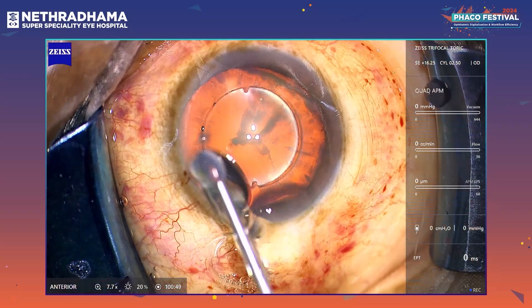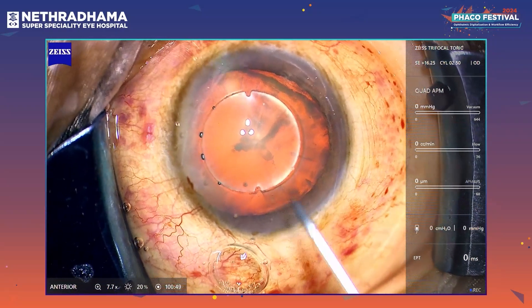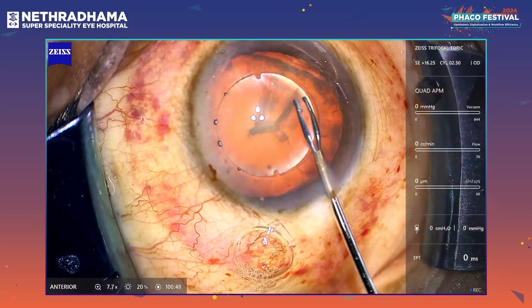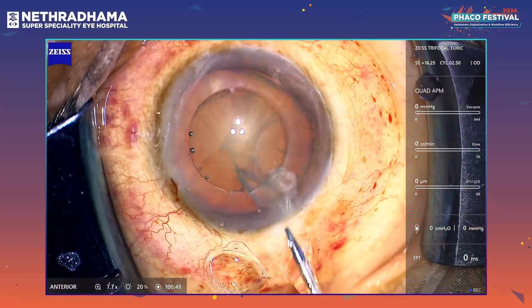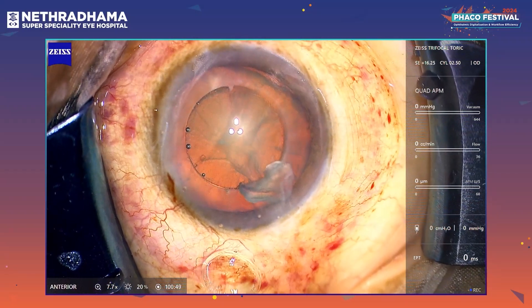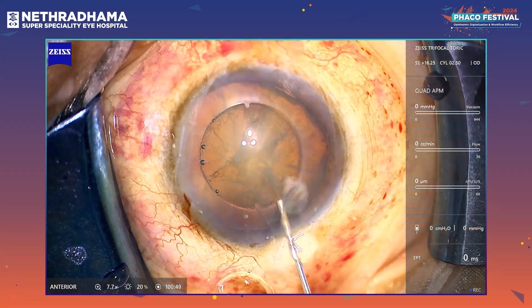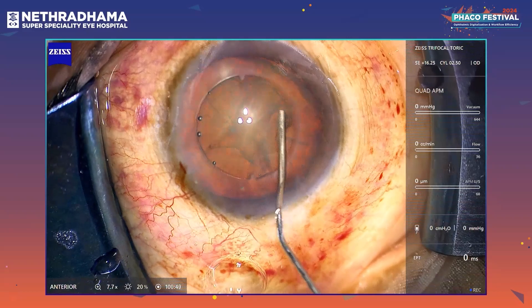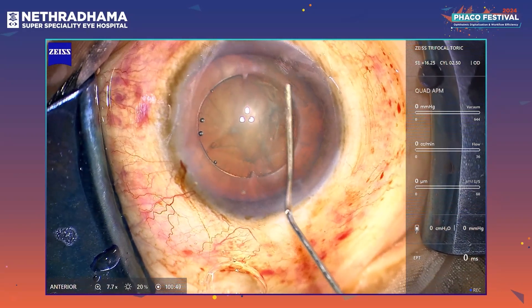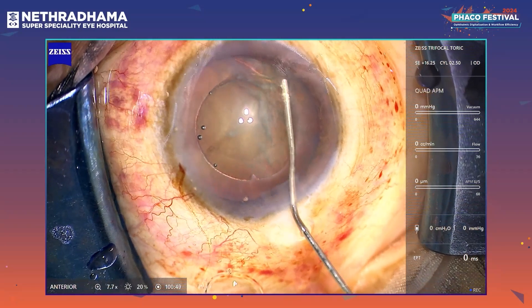I am just using HPMC 2% here, and using a microrexis forceps to peel off the capsule, which is generally free floating. Regarding the toric nubs in the rexis — they are very strong. They are just like an extension of the rexis margin itself. We have never had any capsule extensions or anything with these nubs.